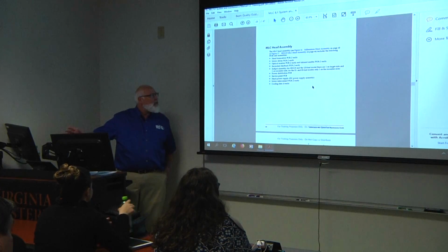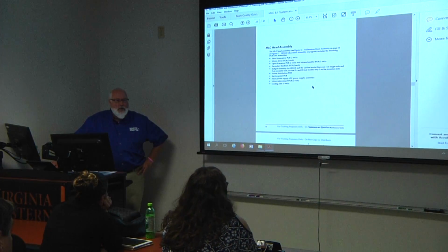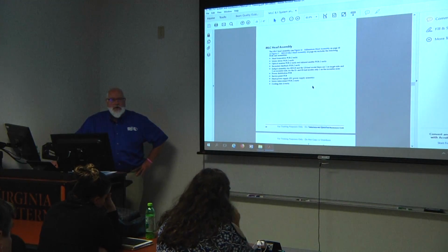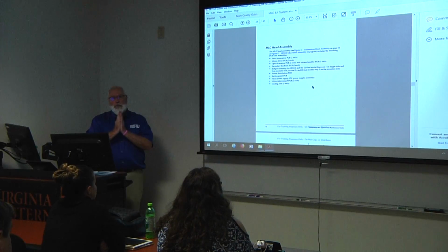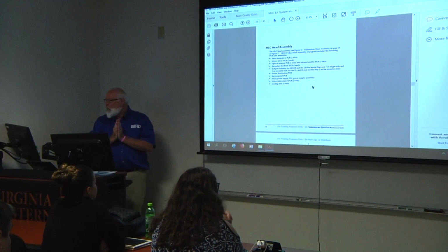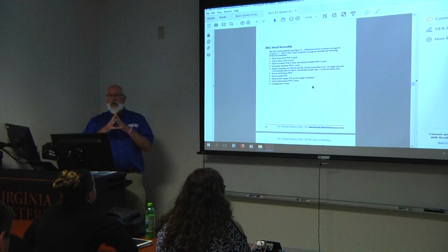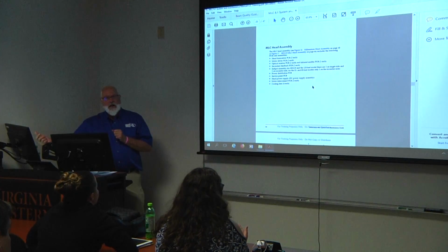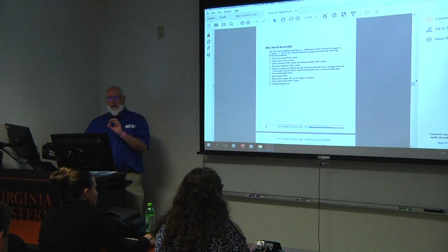And then in your head assembly, this is where we're going to be working. We're going to have a couple circuit cards in there. We're going to have two head transceivers, one for the A side, one for the B side. We're going to have a motor driver board. The motor driver board is behind the head transceiver, and we'll call those the sandwich cards because they're connected together. Going to have two optical receivers, and that is used in the alignment of the system. It also gives you a fault on the MLC that says leaf in field. It has an infrared beam that it shoots across, and it looks for that beam to be broken. And at certain times of the MLC, the beam should be clear.